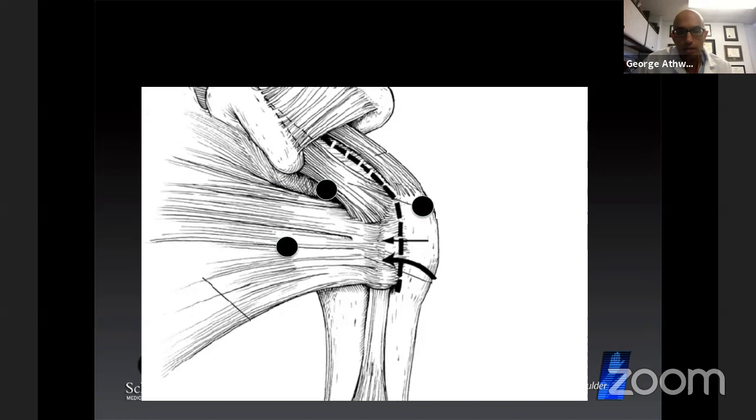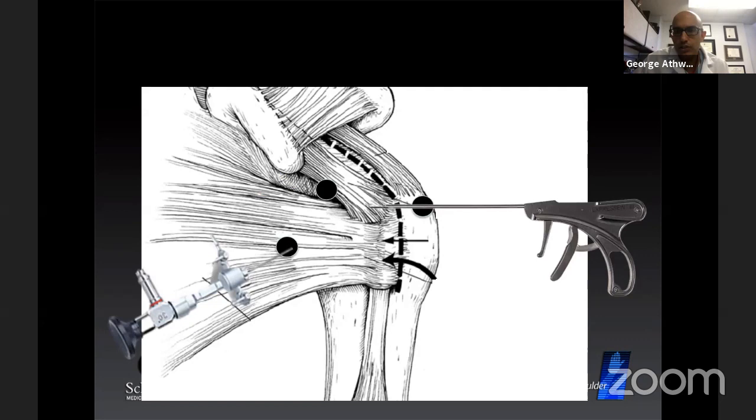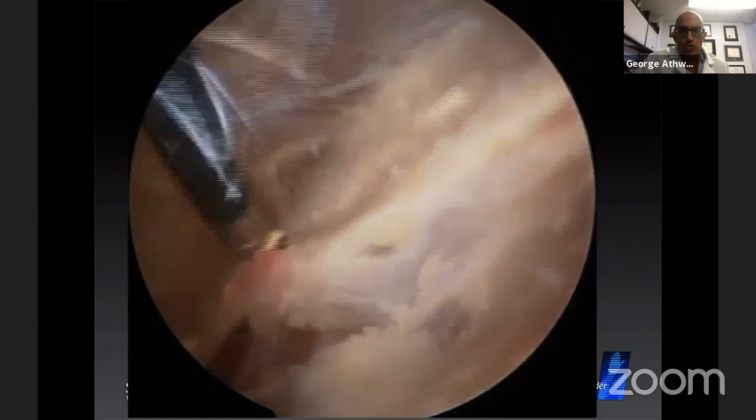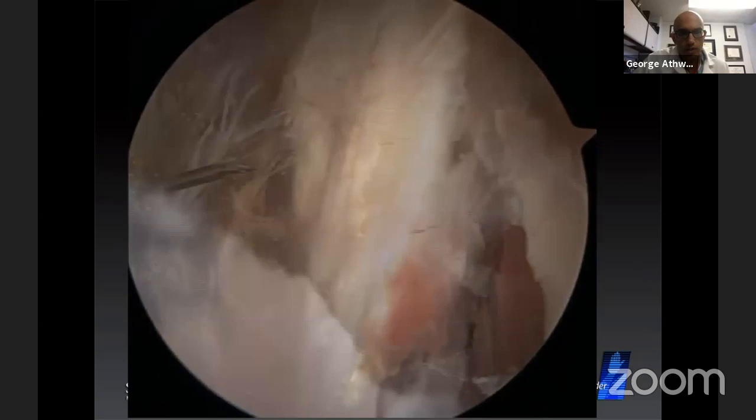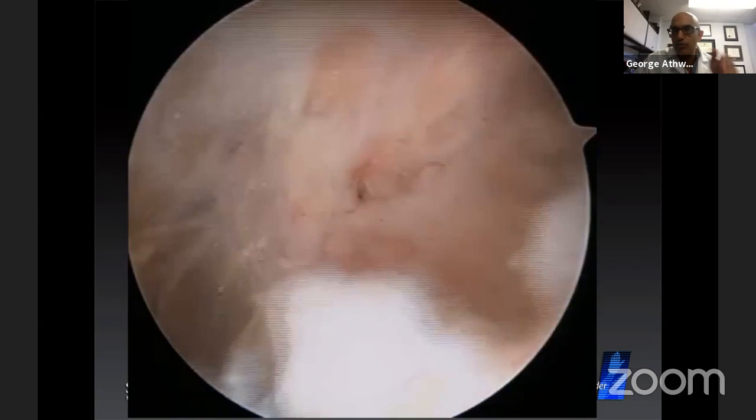So I'm going to place my camera into the delta pectoral portal, which is going to be just a little bit medial to the conjoint tendon. And then I'm going to instrument and pass my sutures from my anterolateral working portal. So right now the camera is in the anterolateral portal. There's the conjoint tendon. And I'm going to go ahead and template the location of the delta pectoral portal. So that spinal needle there is where the camera is going to come in through. So now I'm going to transition and move the camera into that portal.